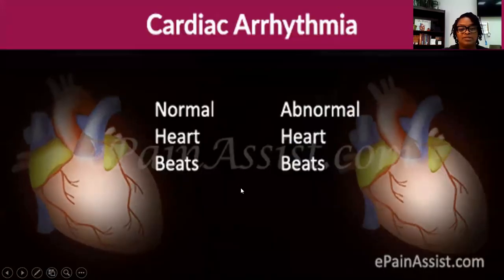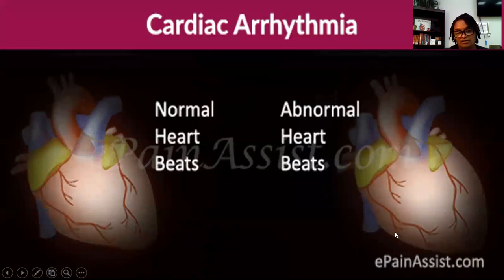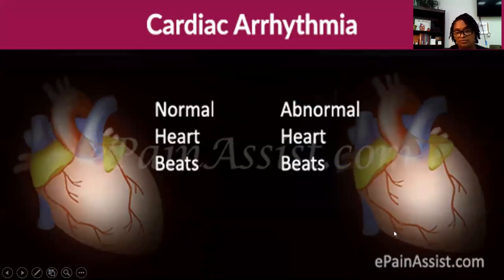So look at our two hearts here, one showing an illustration of a normal beating heart, and look at the difference with the arrhythmia.